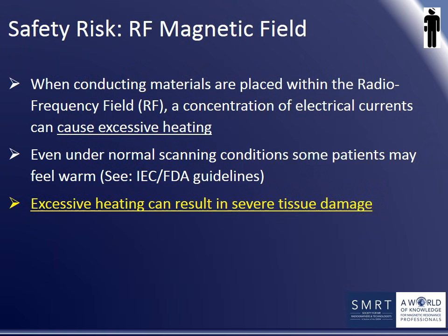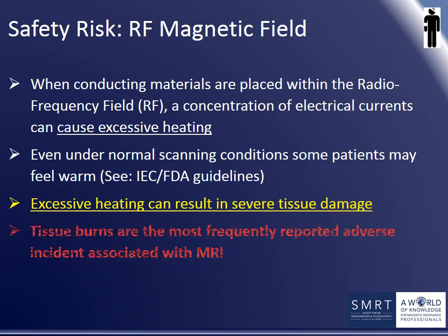Safety risks also exist within the radiofrequency magnetic field. When conductive materials are placed within the radiofrequency field, a concentration of electrical currents can cause excessive heating, which can result in tissue damage. Even under normal scanning conditions, some patients may feel warm. Tissue burns are the most often reported MRI adverse accident.